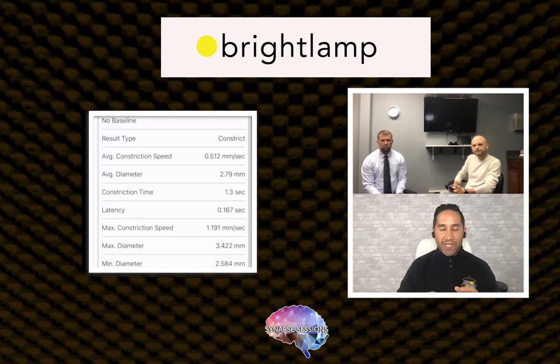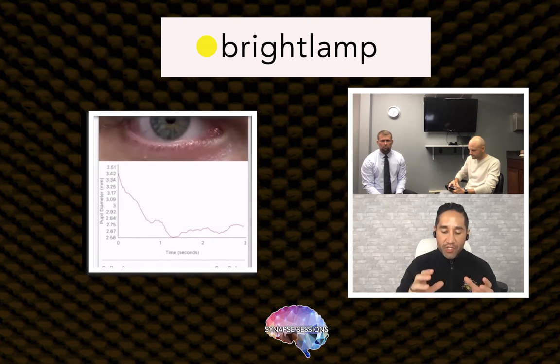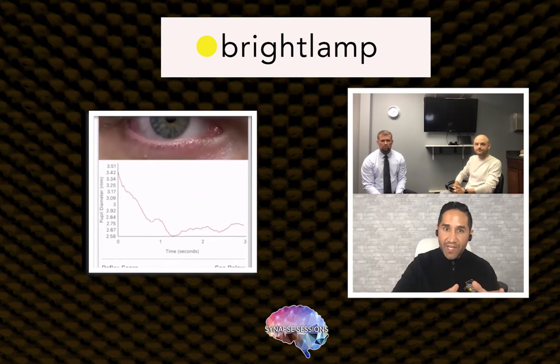Excellent. So Dr. Ralston, I know you use this program a lot. What's the population that you're using it the most with, and how do you glean information that you're pulling from the subjective test relative to the patient populations you're seeing? Like, how do you start applying it? Like you said, the pupillary light reflex that we use at the bedside is sort of subjective. This gives us a really objective data point to measure parasympathetic versus sympathetic flow in the patient.